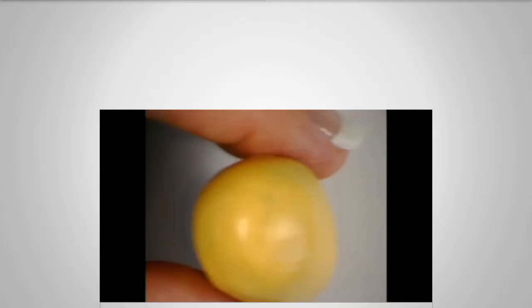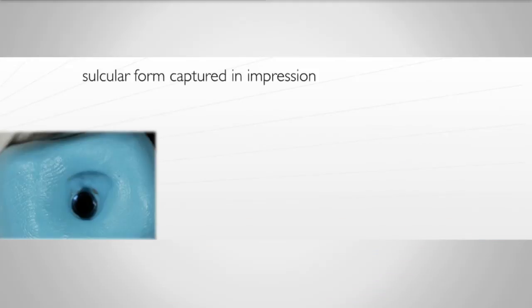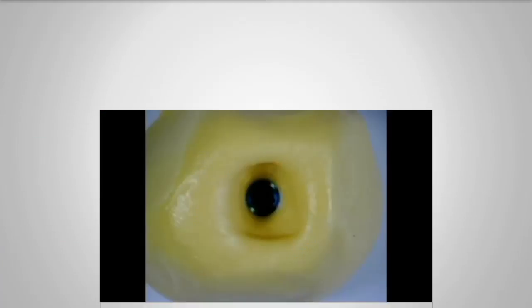All right, let's go to the next step here. So I've captured that sulcular form in the impression. So the next thing I want to do is make a custom impression coping. So let's look at the central incisor again. So here's that three-dimensional form. This is the facial aspect of that central. By the way, what I do now is I mark with a magic marker buccal and lingual, just so I keep this oriented in the right way.